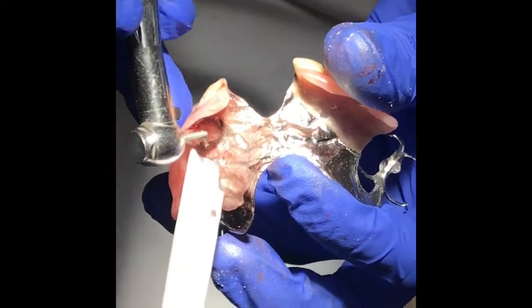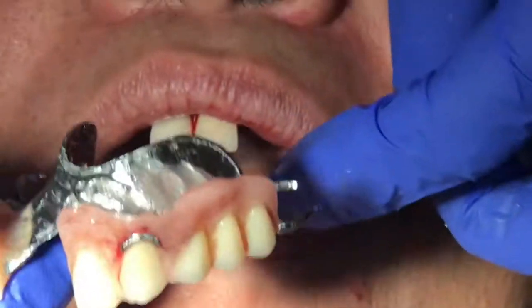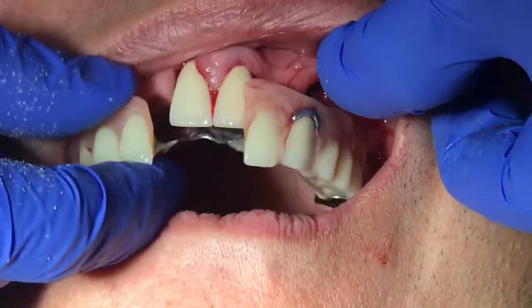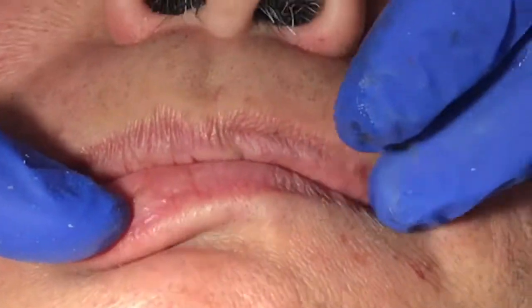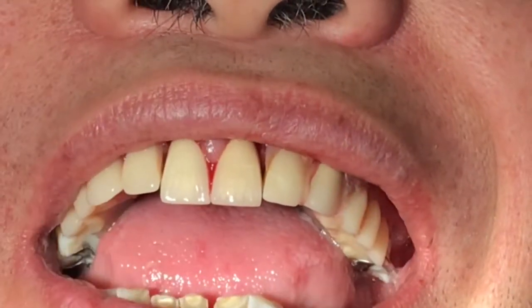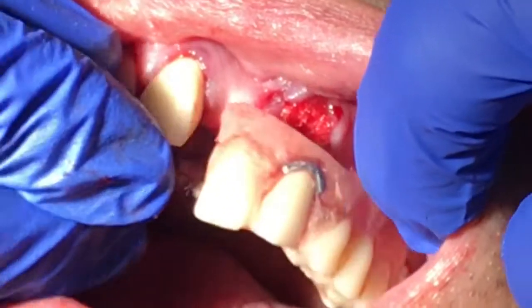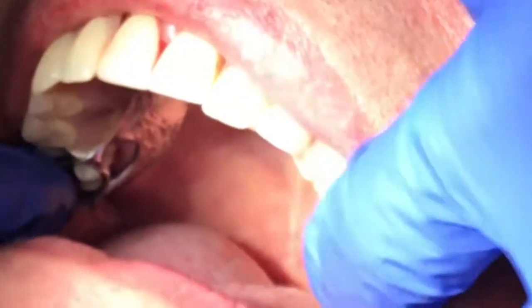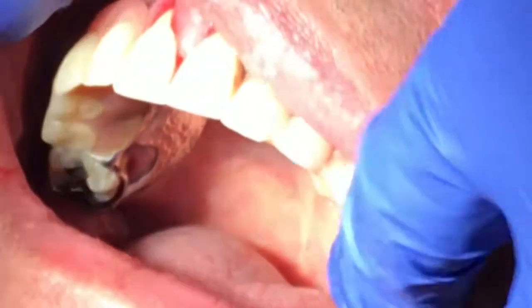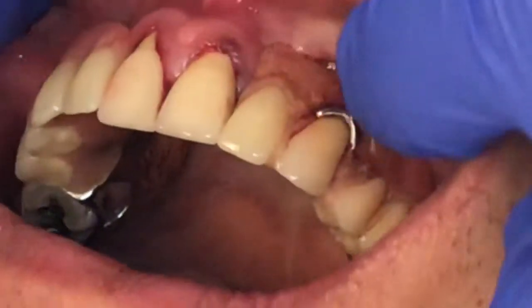The next step is to cut off the post from underneath the crown. The reline procedure is now done. We try the denture in before we take out the tooth — the patient feels comfortable and the denture fits well. We are ready to take out the tooth. We took it out non-surgically. We placed a collagen membrane underneath. The patient is now trying the new relined and repaired denture with the porcelain crown in place on the existing denture.